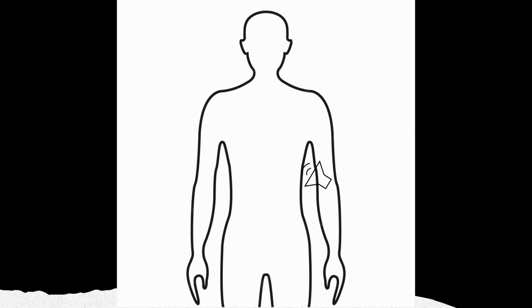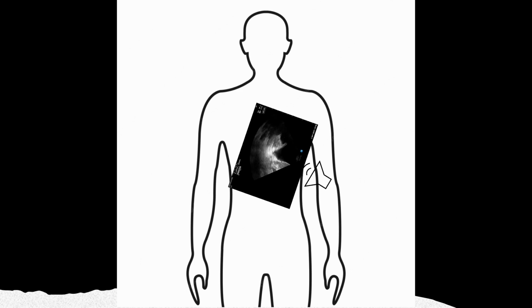I then switch to the other side in the same place and I look. This is what I see. Similar to the other side, I can now see spleen that's on the left, just inferiorly. The diaphragm is the brighter bit just sitting above the spleen, and then it's followed by a black area. Again, you can see something flopping around as the person tries to breathe, and that's collapsed lung with fluid all around it.